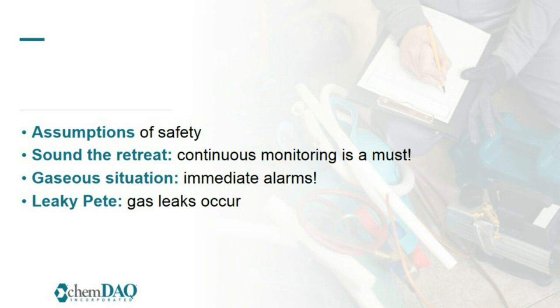One customer that I visited had 4 new STERIS sterilizers, and with continuous monitoring discovered that each of the units emitted between 25 and 40 parts per million of H2O2, or hydrogen peroxide, upon opening the door. So upon discovering that, this customer now sounds the retreat. I can almost hear the bugle blowing where they sound the retreat, they open the door and they run out of the room and they let the room aerate until they believe that it is safe. They return to the room to take the load out of the sterilizer.